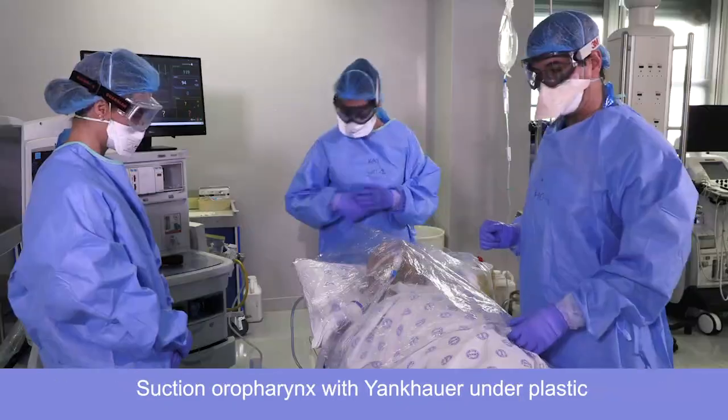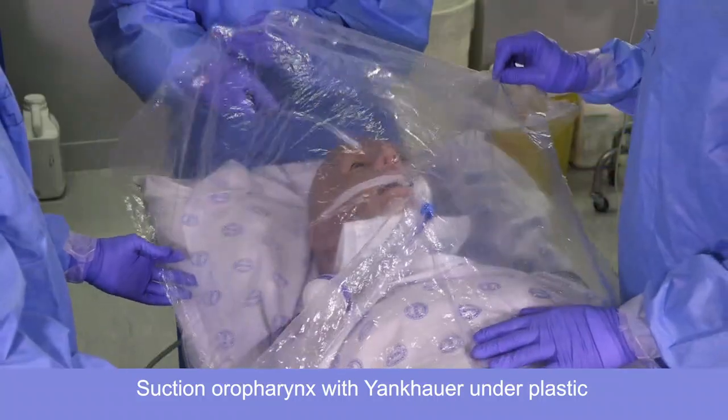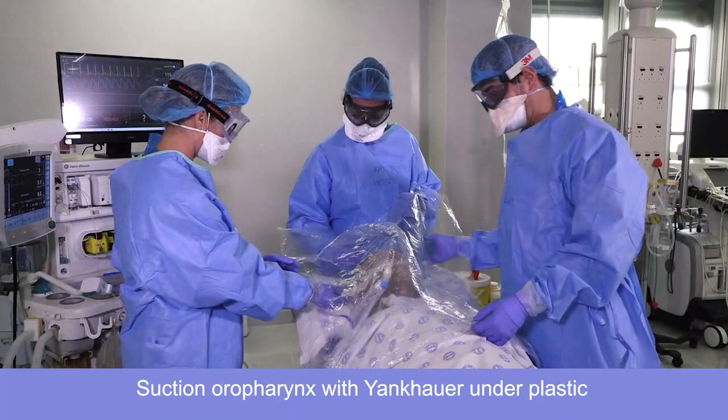Can you suction the patient's airway for us please? Marietta, if you could get the mask and the syringe to deflate the cuff ready. Your mask and your syringe is ready.